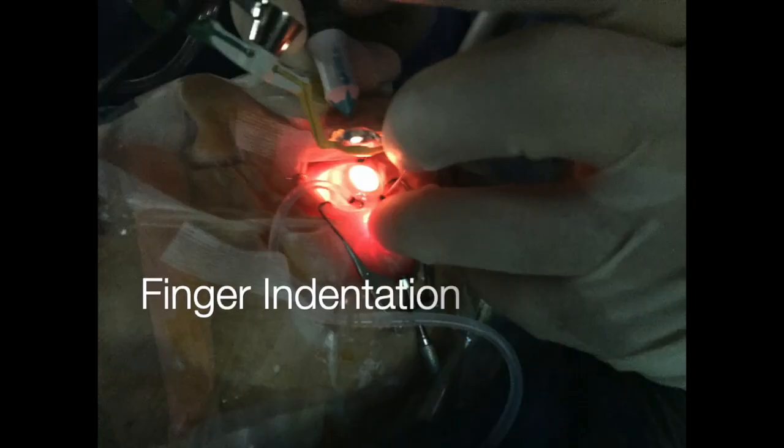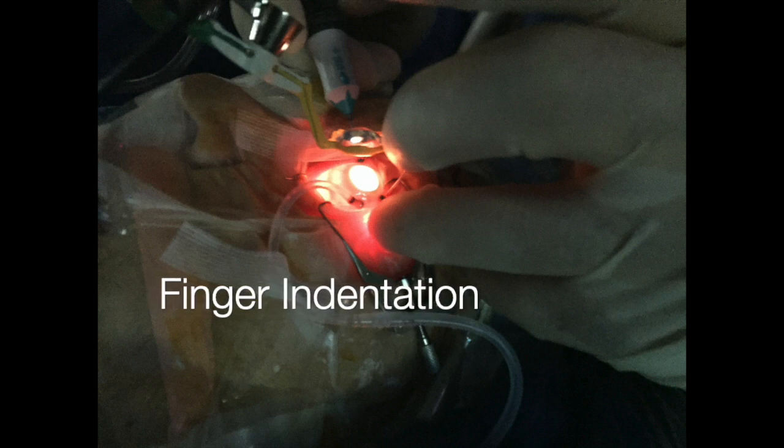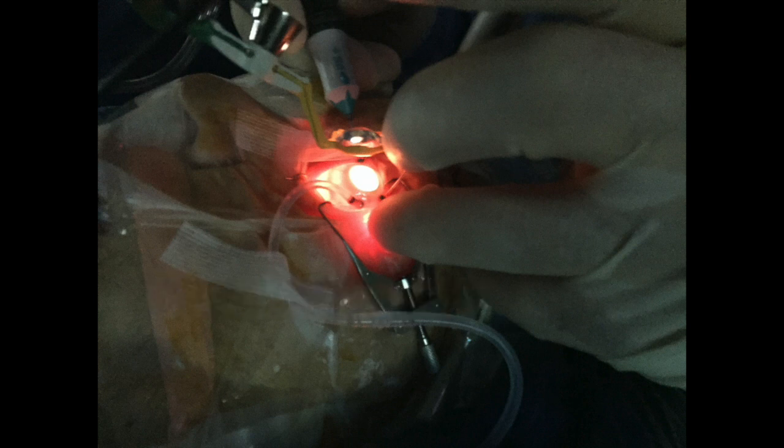This is how I did the self-indentation, which I think is a useful tip. Unfortunately it doesn't work very well except on the temporal half of the eye; on the nasal side it is very difficult to do.